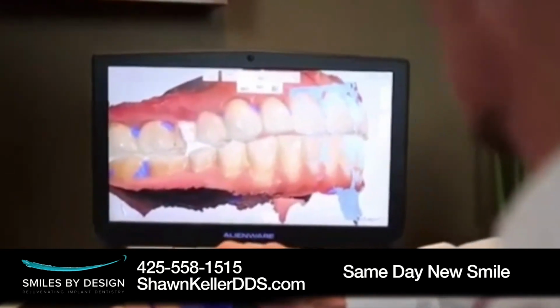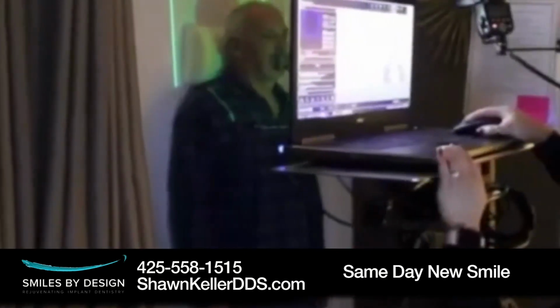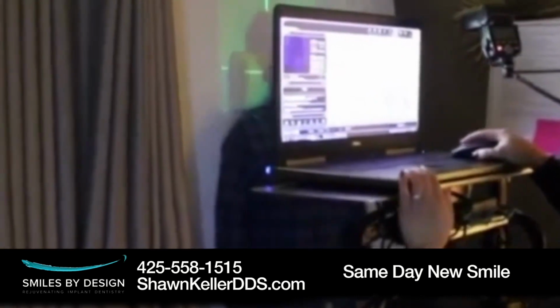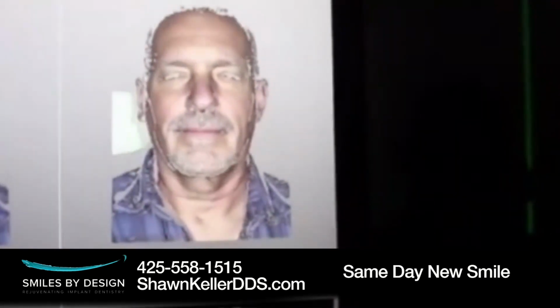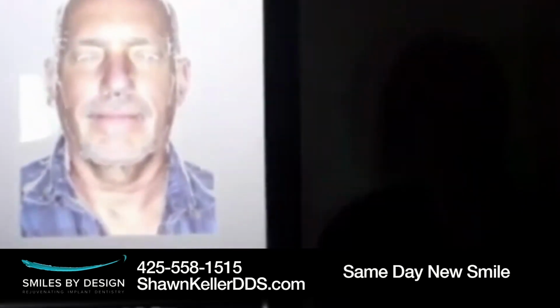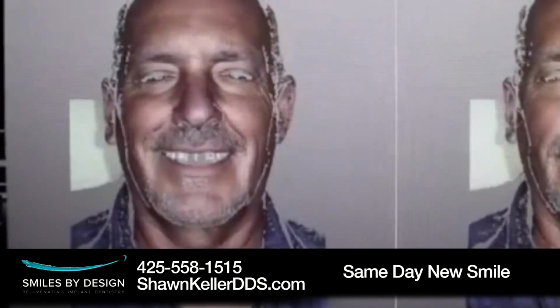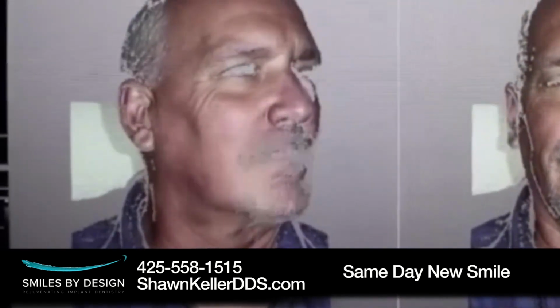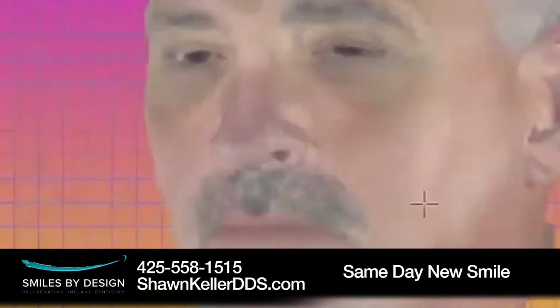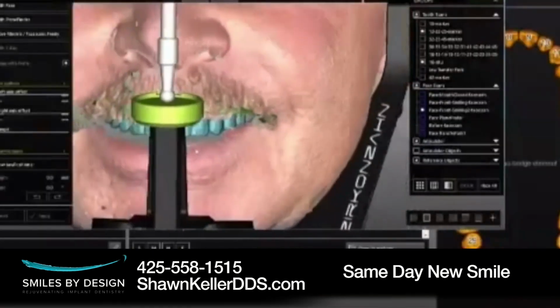Okay. The 3D scanner is a really cool new technology where we actually have a few of them at the office. One of them, we scan the teeth. So instead of taking those big goopy impressions where you gag and you bite into that, I hate those. You have to retake them. They take about 10 minutes of sitting there gagging with it. We just have this little gentle 3D scanner. It almost looks like a little toothbrush, and we scan the teeth, and we get a highly accurate copy of your teeth from that.